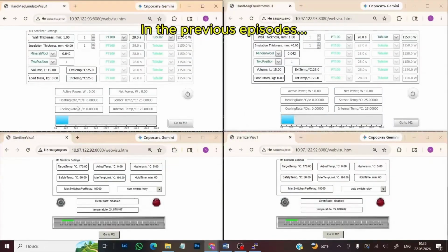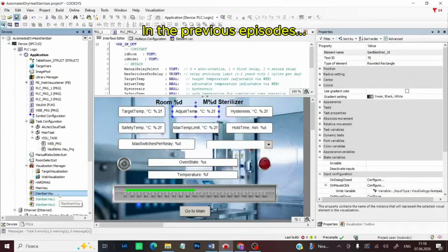Now, our prototypes support at least 2 models of sterilizers with different characteristics, such as the type of thermal insulation material, the volume of the sterilizer chamber, the number of heating elements, and the number of internal temperature sensors. Since the visualization interface is absolutely identical for any sterilizer model, you can use just one file for all 100 models instead of having 100 identical ones.